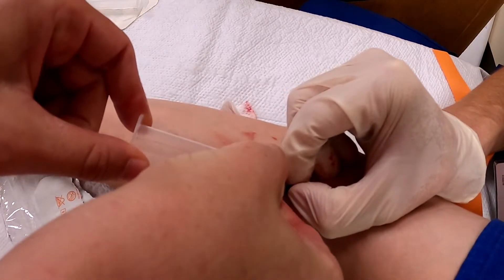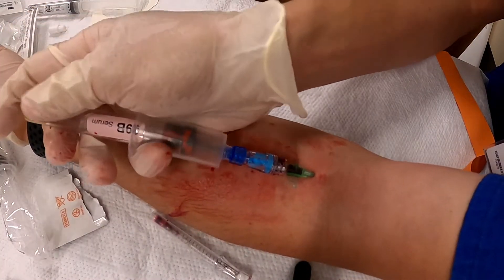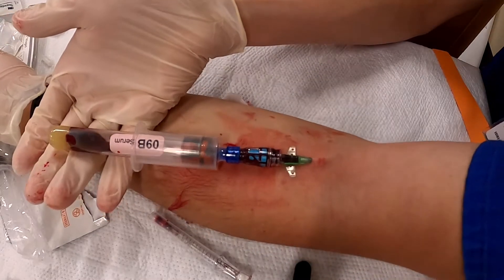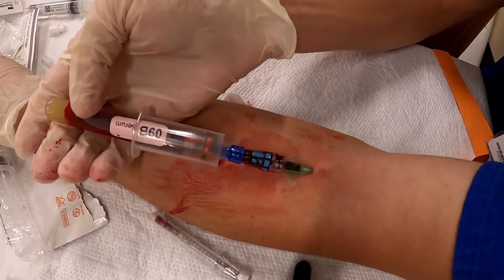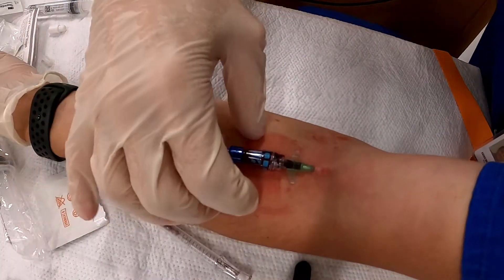We had great flash, we got great flow back on that needle, and the tube is filling easily. Again, don't always draw blood on a stick like that.